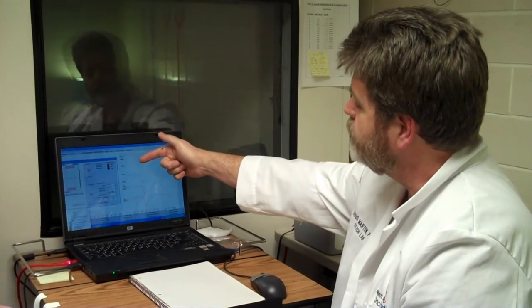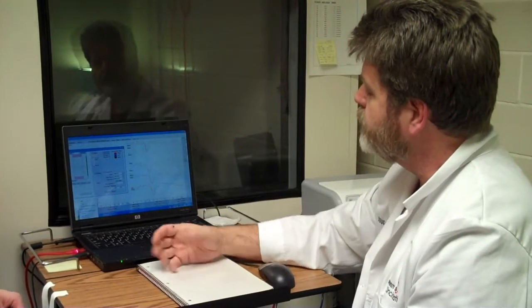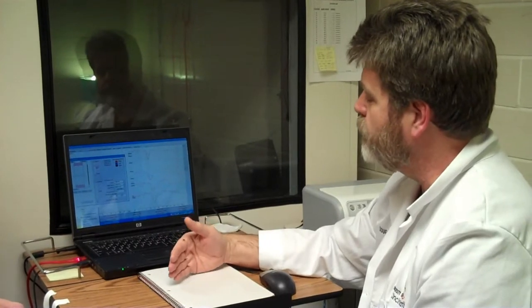The strength of these peaks tells us the strength of the response in Q's ear. What we are trying to follow is this big peak right here, and we are presenting the sound at progressively lower intensities, trying to find the lowest level that will give us a repeatable response to tell us if Q has normal hearing or not — which Q in fact does have normal hearing.